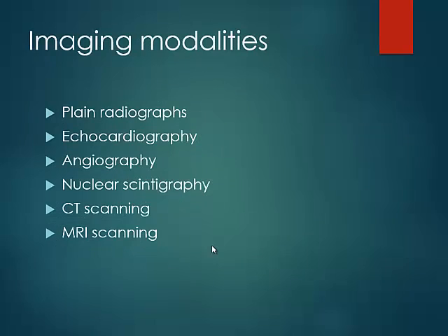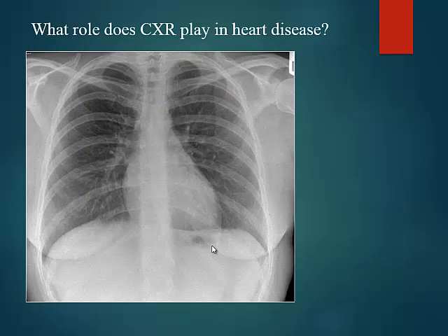And we have seen that from Dr. Fox's talk earlier, that we have a range of modalities that we can use to assess these different aspects of the heart. But the important question is, what role does the chest X-ray play in diagnosing heart disease? So anyone, what is the most important thing that we still use a chest X-ray for in a cardiology department or from cardiologists?